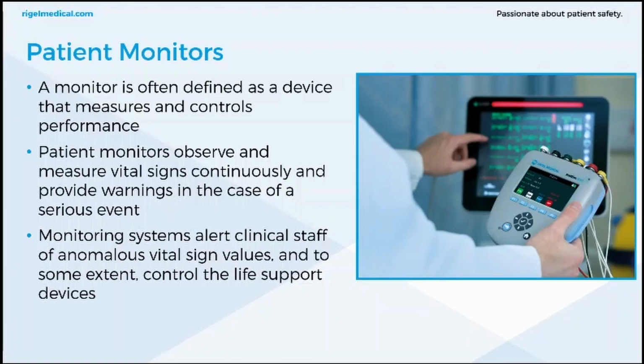Patient monitors. A monitor is defined as a device that measures and controls performance. Patient monitors observe and measure vital signs continuously and provide warnings in the case of a serious event. Monitors, or monitoring systems, alert clinical staff of anomalous vital sign values and to some extent control the life support devices. These comprehensive monitors are widespread. They're globally used in healthcare facilities. You'd be hard pressed to find a healthcare facility that doesn't use patient monitors. They're absolutely everywhere.